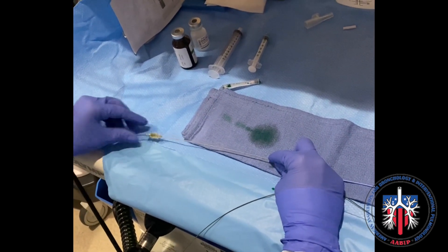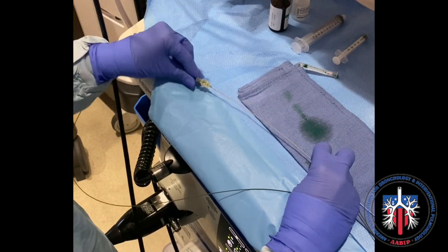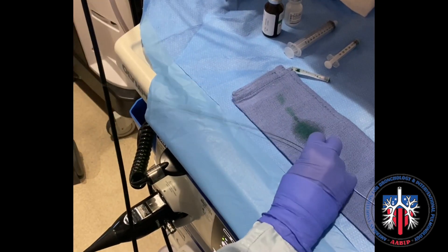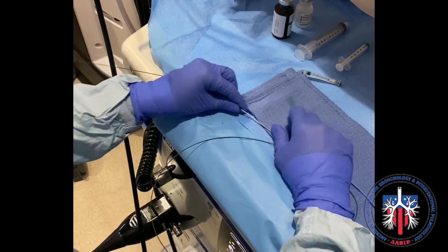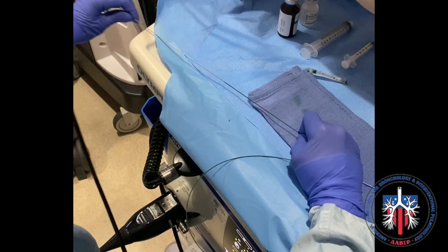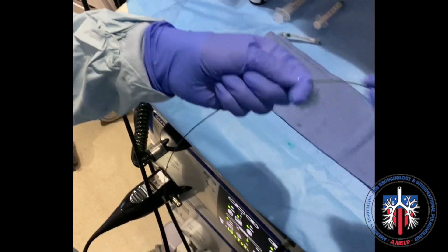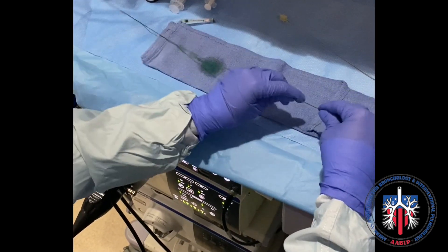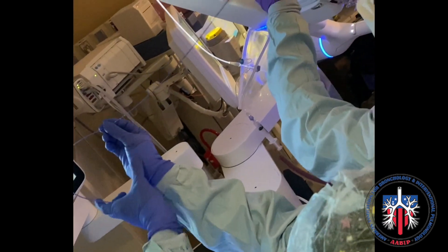The loader is attached to the tip of the catheter and then pushed with the guide wire that comes with the kit through the loader into the loading catheter. When the whole unit of the fiducial and guide wire is within the catheter, the fiducial loader is removed. The fiducial coil is now within the loading catheter and the guide wire is advanced to a level where it is ready to be pushed out. The catheter is then advanced within the robotic bronchoscopy working channel.